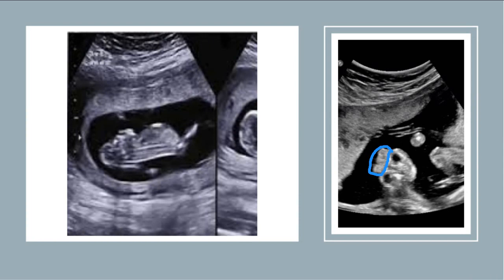We're not seeing any sort of normal looking brain parenchyma. Now on this baby on the left-hand side, again, we see a stump at the end of the spinal cord where maybe the baby's head would further develop, but we see a little bit of face structures here, slightly abnormal in their development as well, but we don't see anything above that where the brain should be.